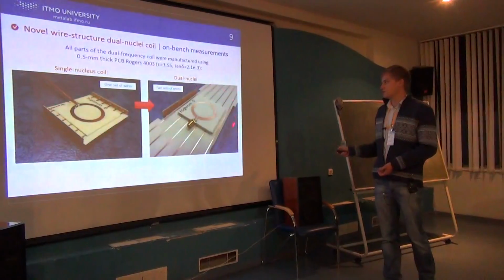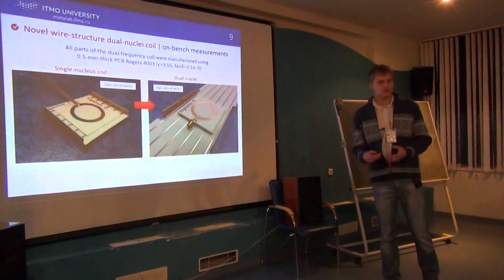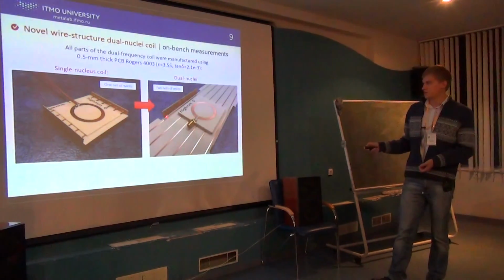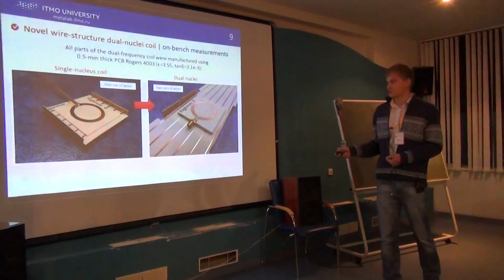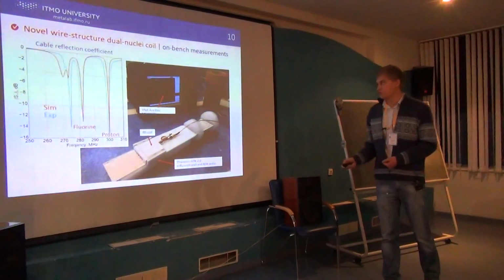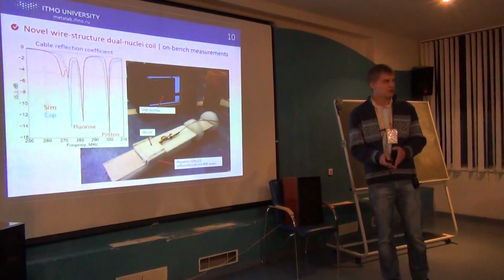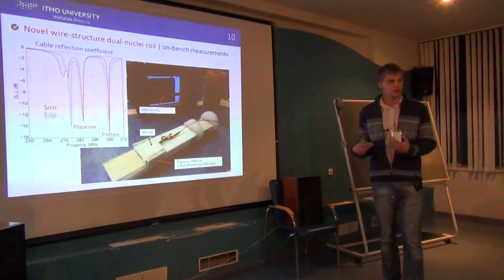So this is the photo of the PCB boards which are used for this sample, for this radio frequency coil for two frequencies. So these are the long wires. They are printed on the substrate, and below there are the short wires loaded with system of patches, also realized as PCB boards. And this is the feeding loop, which is non-resonant itself. And by means of vector network analyzer, we can check that really we have two resonances, and our impedance matching is very good. So all the energy applied to this antenna goes to the subject at two desired frequencies. And we can tune these frequencies, and we can match the impedance of the antenna.